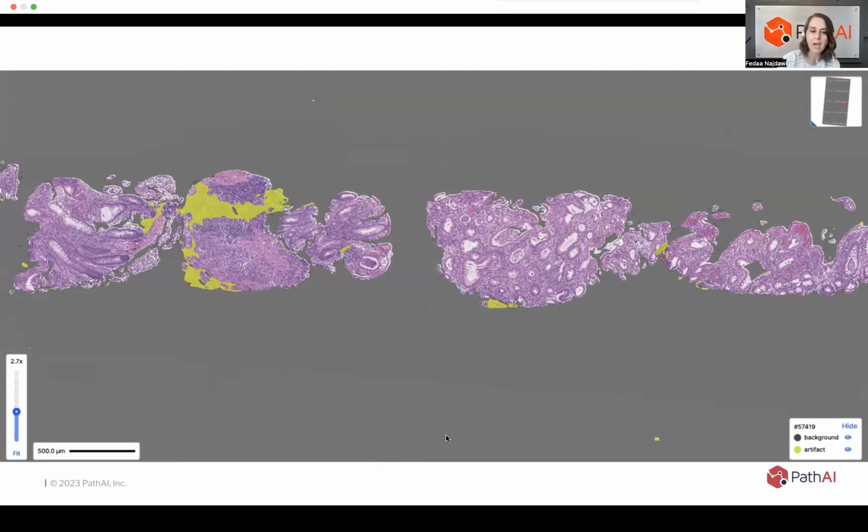It might also have background predictions in areas where there are tissue cracks, and that is expected, but that should not include crypt lumen or blood vessel lumen. Artifact would be any area of actual artifact that renders the tissue unevaluable, so areas of crush or blur that will prevent you from making any kind of call or assessment in that specific region.